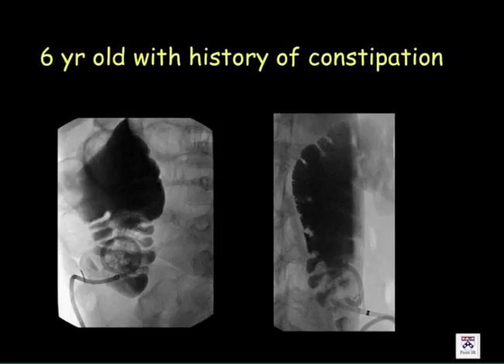Number two, if the patient is leaking around the tube, try to find the reason why he's leaking, and don't try to upsize it. It's okay to upsize once. Sometimes something happens and it stops leaking. But that's it. Because if you upsize once and the patient stops leaking, and 3 days later the patient comes back, that means you upsize a second time, a third time, and they get a 24 French tube in the stomach. And the patient will continue to leak. The only difference is you have a huge hole in the stomach.